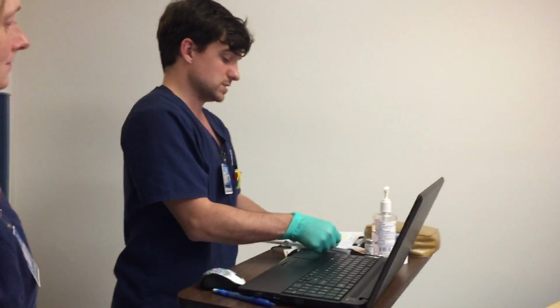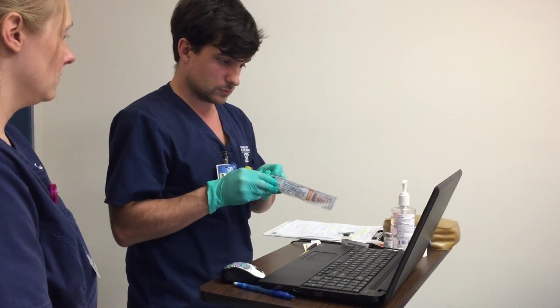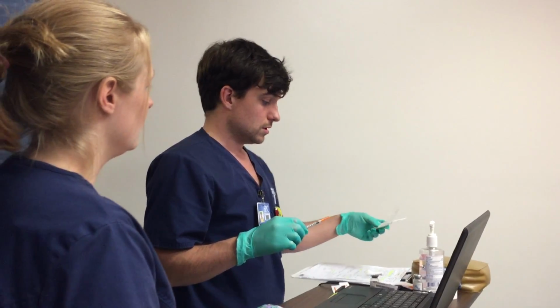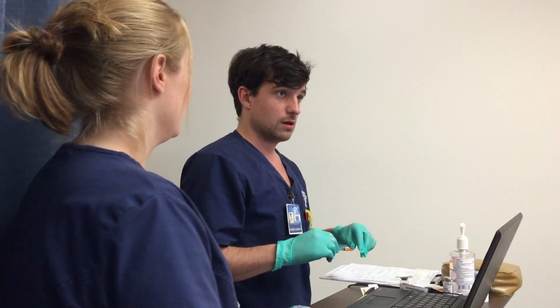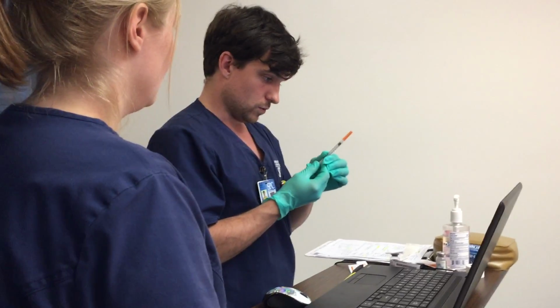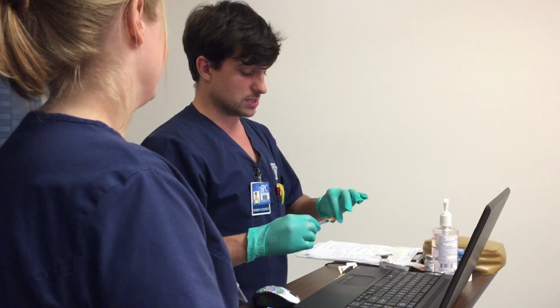After 15 seconds are up, we are going to take our needle after having verified everything, which we've done 100 times, and we're going to draw back, because it says so, 6 units worth of air to inject in the insulin bottle, okay?